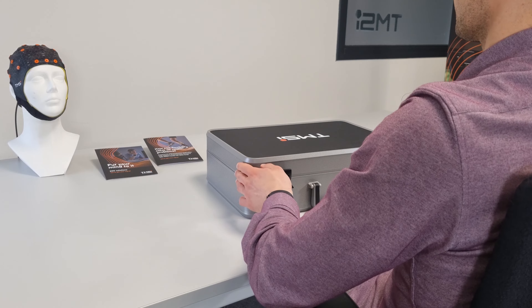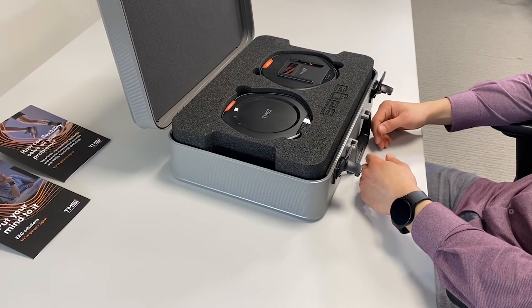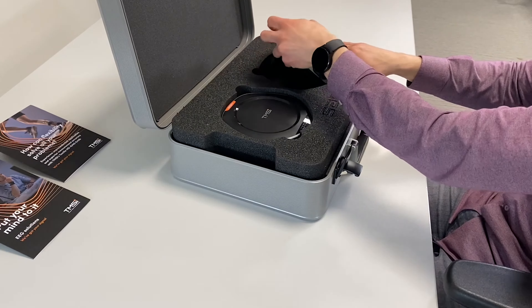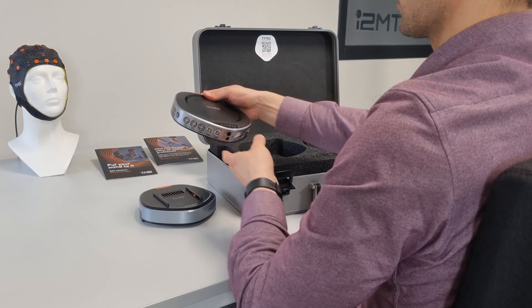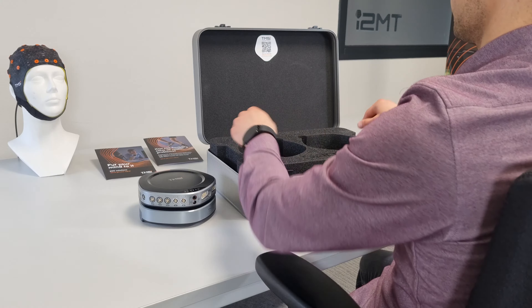Upon opening the suitcase, you will find the device on top, firmly packed to prevent any transport damage. The first part of the Saga is the docking station that performs the connection to the PC and can receive triggers. The second part is the data recorder that records the physiological data. The data recorder can easily be slid onto the docking station, which is called the docked position of Saga.